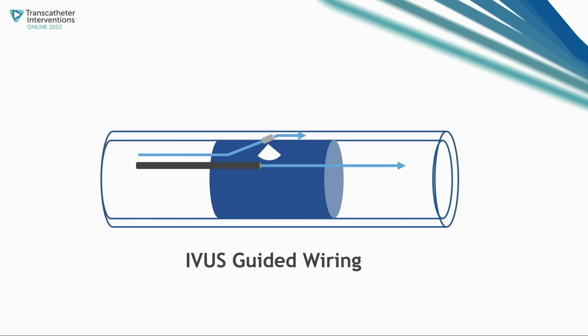So you use the IVUS on the first wire to allow you to see your second wire in the microcatheter, to determine whether your course is tracking intraplaque or whether, again, you're entering the subintimal space. So an additional use of IVUS, in addition to all the other uses that Ajay's already discussed.